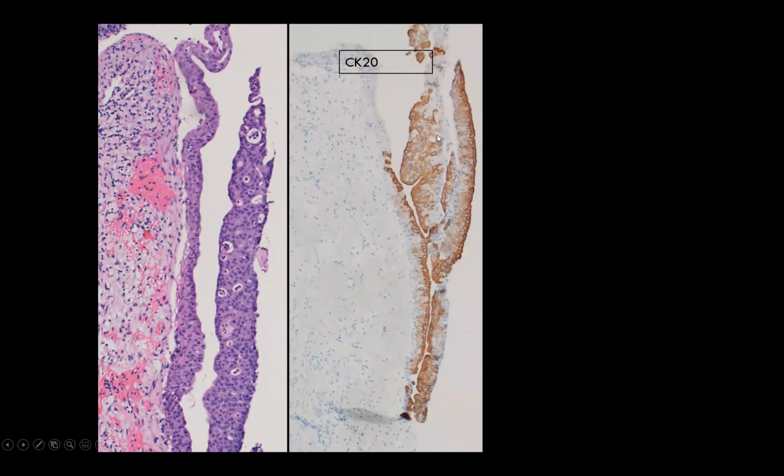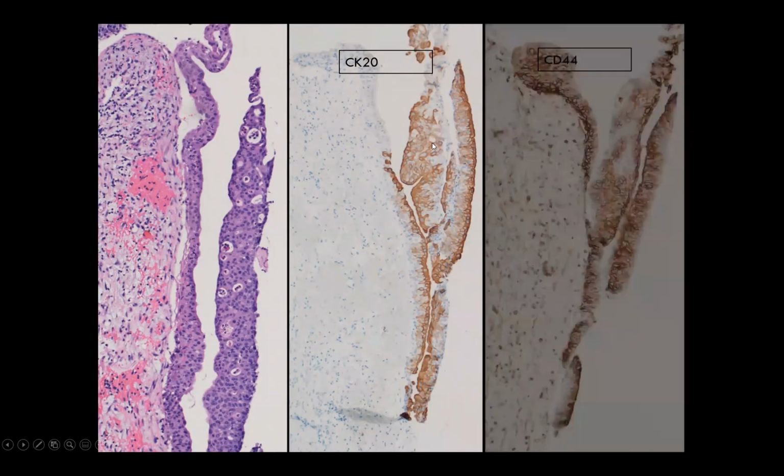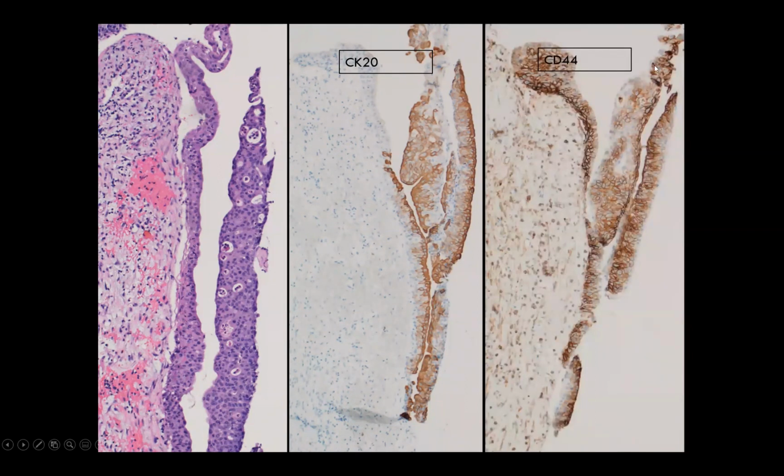And so when one sees this, you might think, okay, this is carcinoma in situ. But when you do the CD44, you will see it shows almost a similar pattern. Also, almost full thickness staining like you would see in a reactive condition. So how does an immunostain help in this condition to call it CIS versus reactive? You just cannot, right? So immunostains are not the answer for reactive versus carcinoma in situ. In some cases, they might help confirm or refute your morphologic impression, but please remember that your morphology is always number one when it comes to diagnosing these flat lesions.